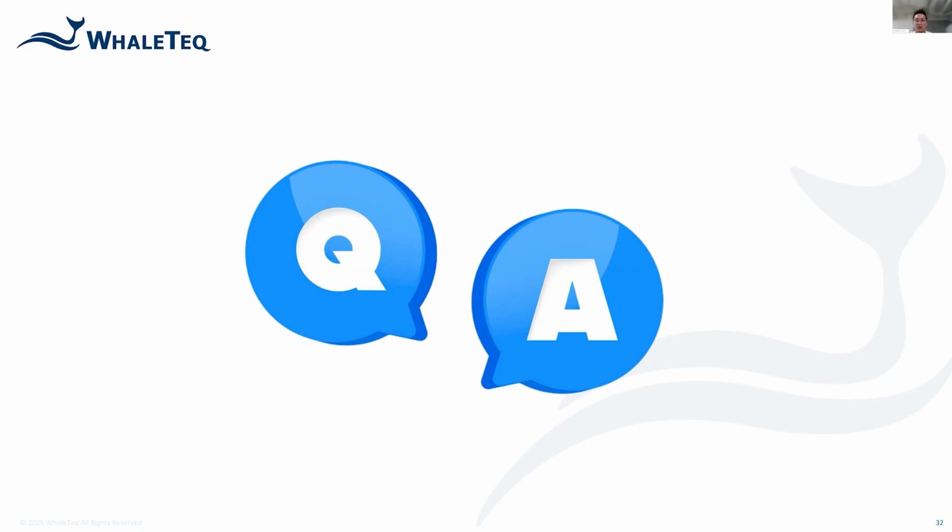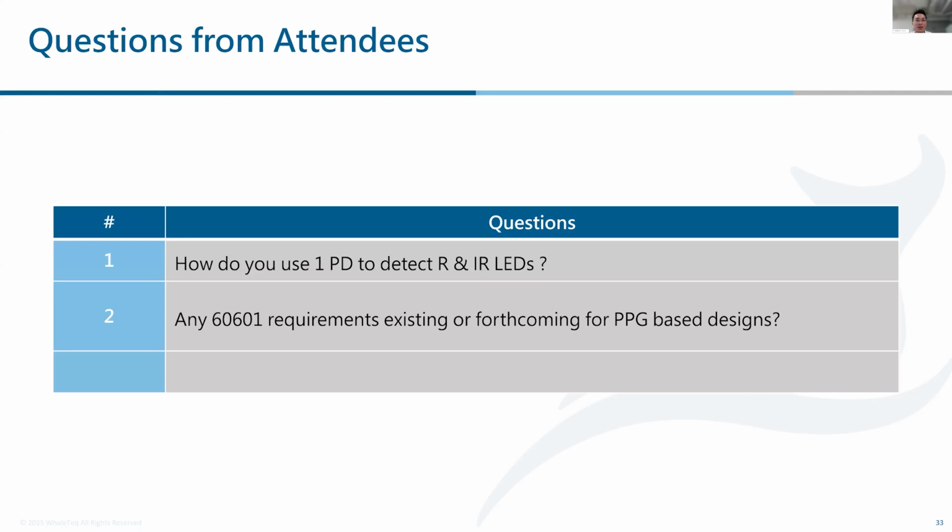All right. And please keep typing, keep asking questions. Thanks. And we just need to cover in case this attendee wasn't there. So there were two questions about how do you use one PD and detect RNIR LED, because you're seeing that we put one LED in the middle, and how can our one PD detect RNIR?